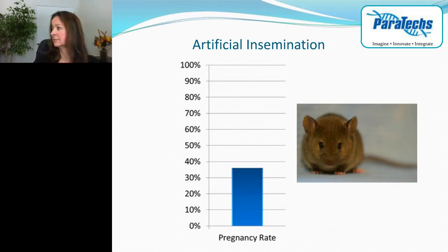Great. Okay. The next question is about the video. Is the mouse in the video anesthetized? And kind of a follow-up to that, aren't you afraid of biting? The mouse in the video has not been anesthetized and is simply being held in a position which tends to make the mouse freeze in that position.